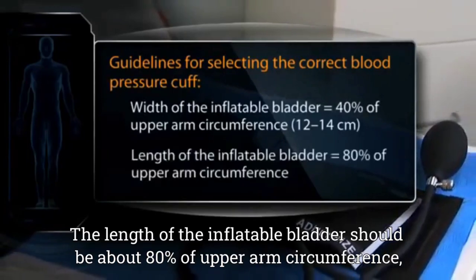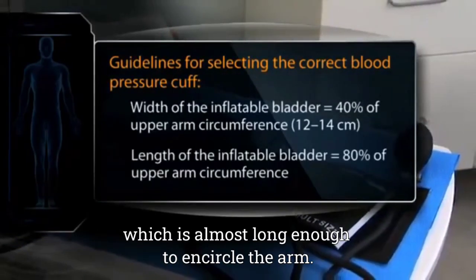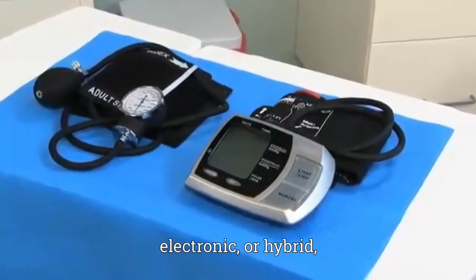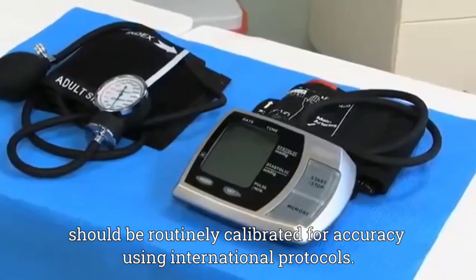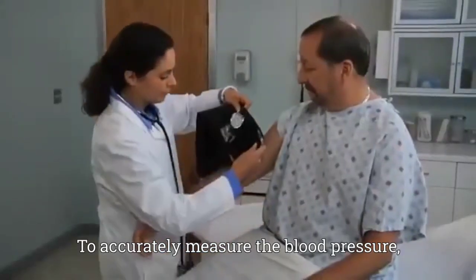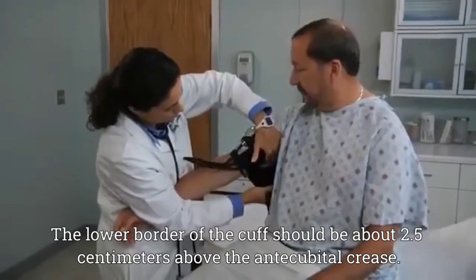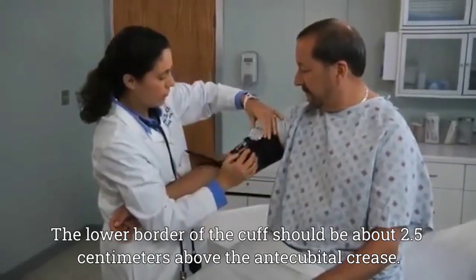The length of the inflatable bladder should be about 80% of upper arm circumference, which is almost long enough to encircle the arm. All blood pressure devices, whether aneroid, electronic, or hybrid, should be routinely calibrated for accuracy using international protocols. To accurately measure the blood pressure, center the inflatable bladder over the brachial artery with the arm at heart level. The lower border of the cuff should be about 2.5 centimeters above the antecubital crease.